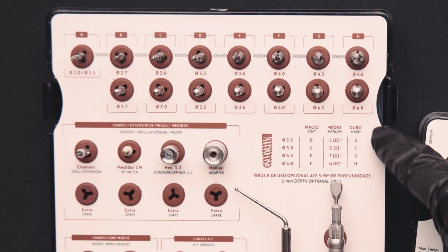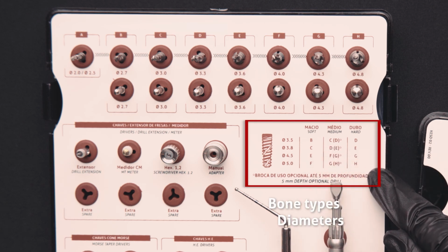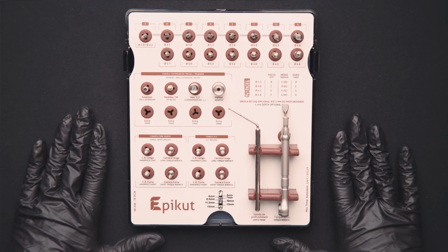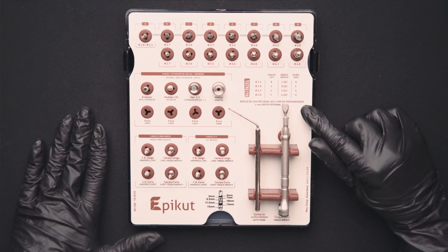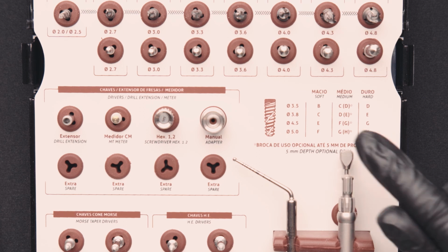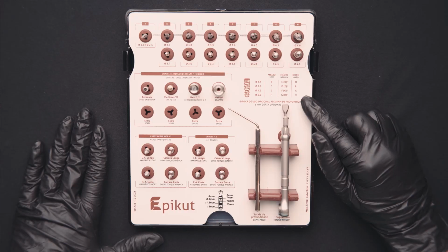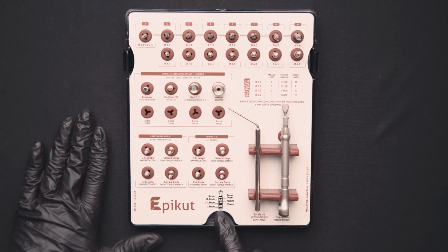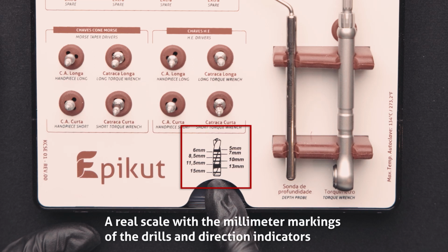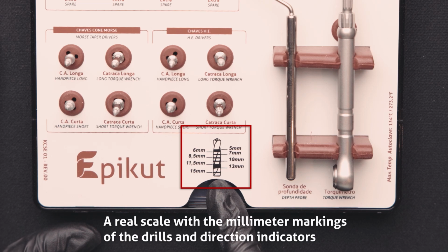In the kit, there is an identification for different bone types and implant diameters to guide us through the drilling sequence. As general features of the Epikut kit, it is possible to see here a drilling sequence instruction description for all diameters versus the bone types that will be used. In addition, as for all other S.I.N implant system kits, it is possible to see in this bottom part a real scale with the millimeter markings of the drills and direction indicators.